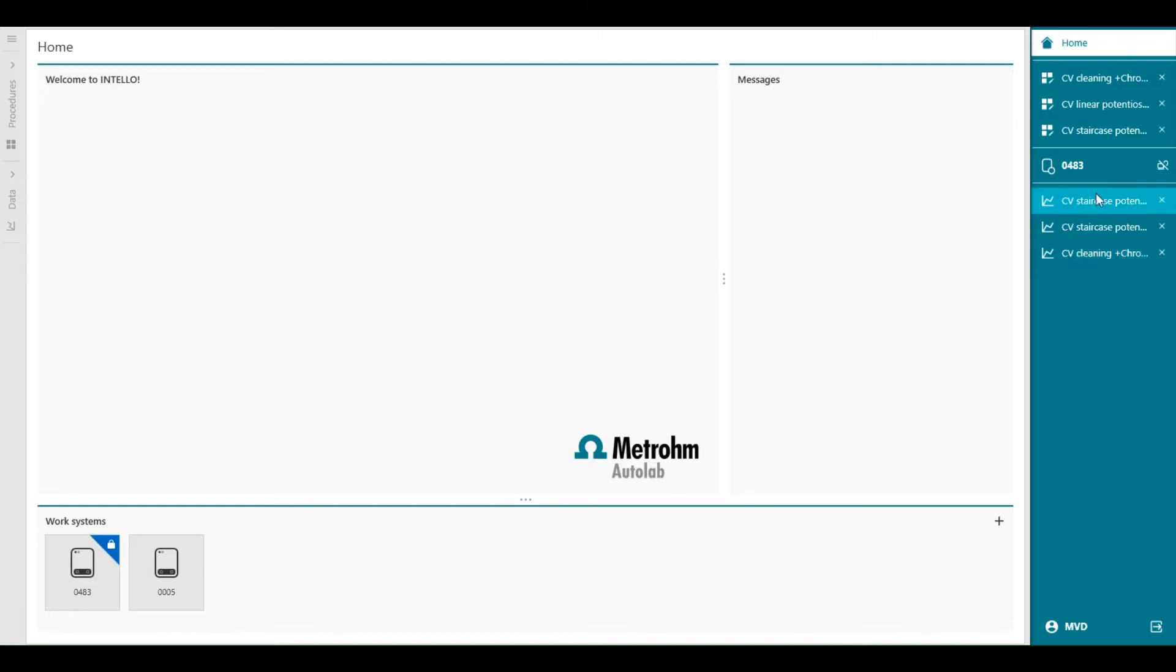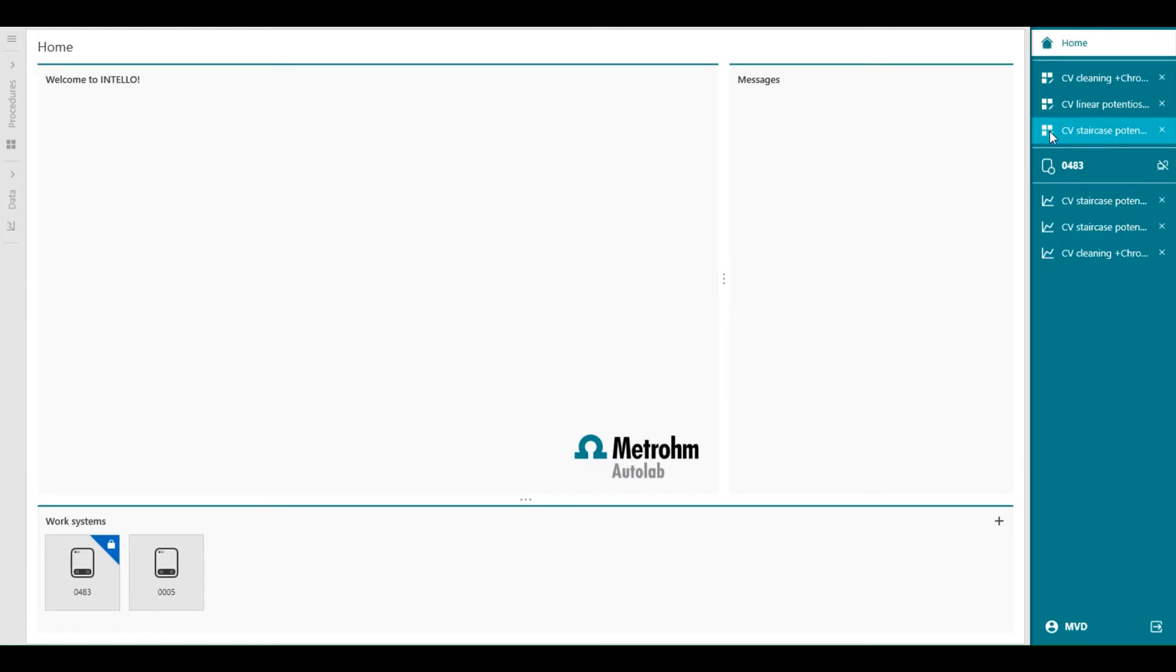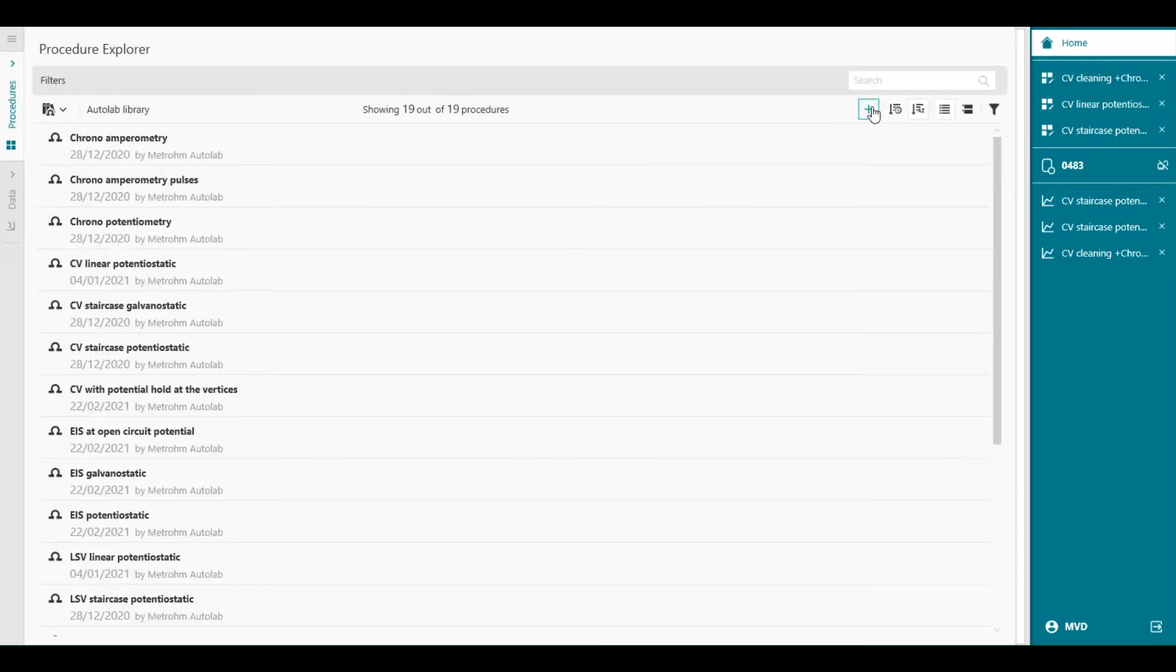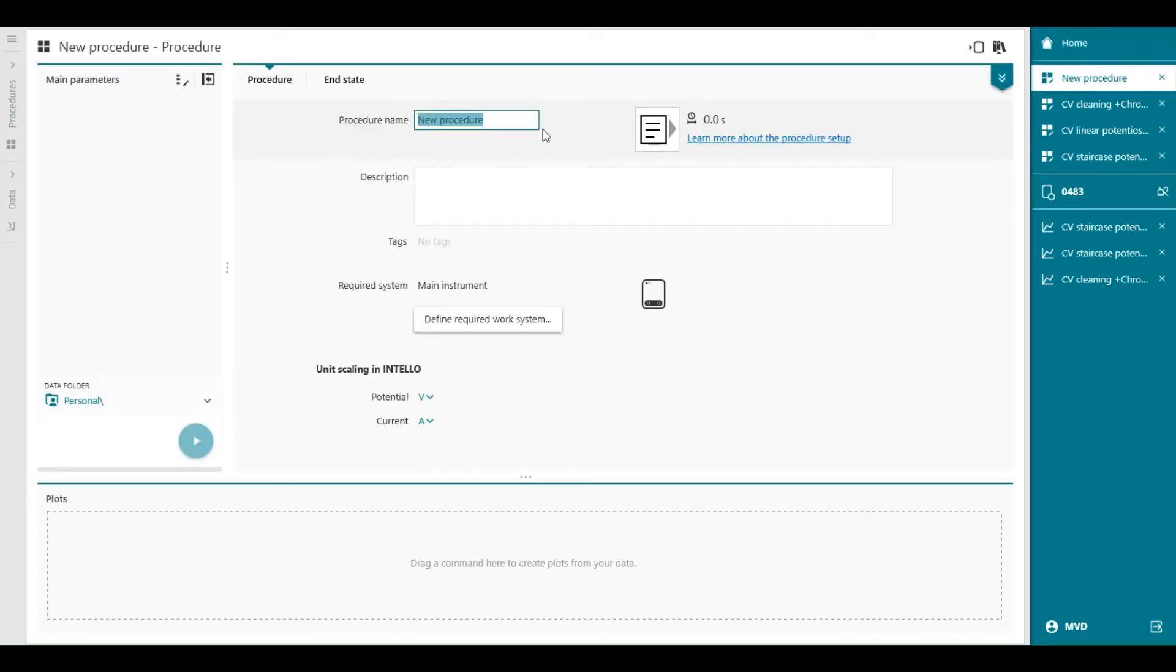This section is the procedures in preparation. You can see this by the pencil icon in the procedure tiles. When you create a new procedure, this procedure is placed in the preparation section. So for example, if you start a procedure completely new, you can first give the name, say test navigation panel.